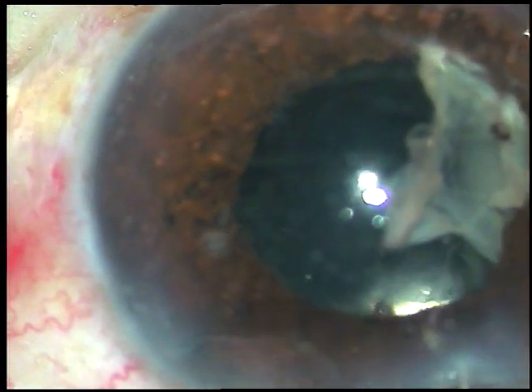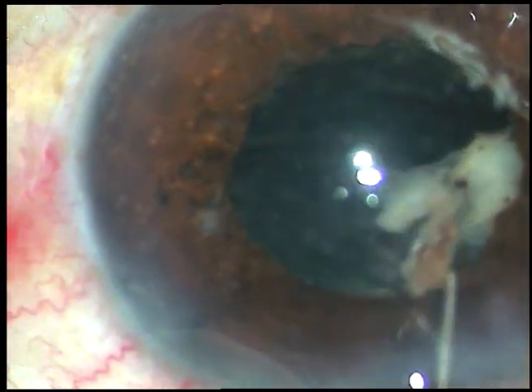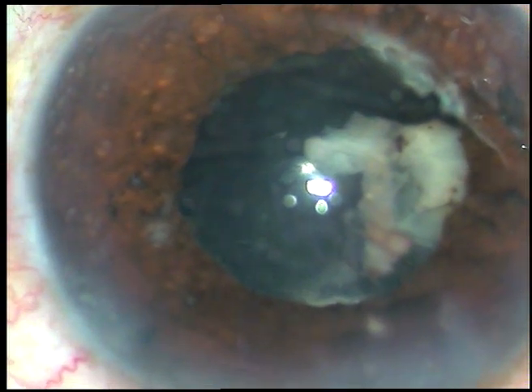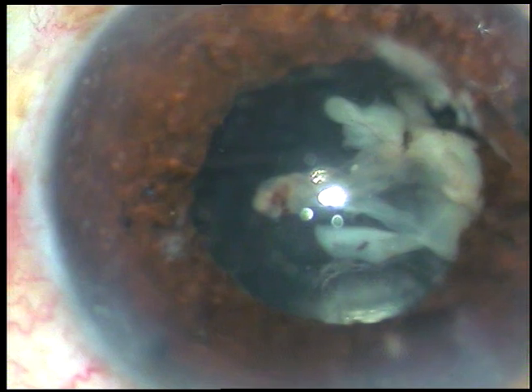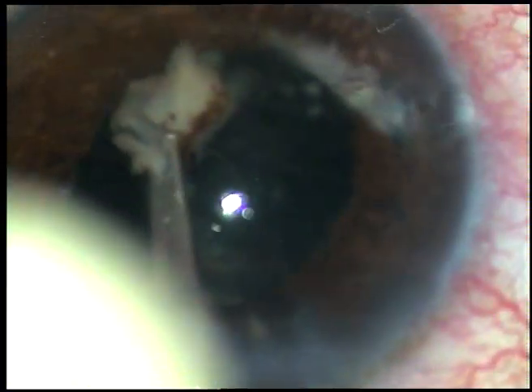Now I try to separate this with the Sinskey hook. But the portion attached to the pupillary margin from about 9 o'clock to 10 o'clock is firmly attached. So I inject viscoelastic again and take a Macpherson's forceps. We can see the intraocular lens sitting nicely, and as I pull it, the membrane gets detached — and I could remove it in total.